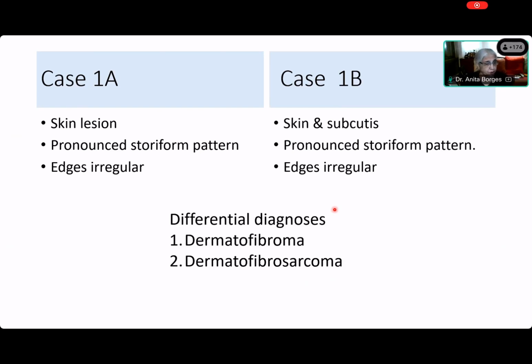Now, what differential diagnosis did you come up with, Saida? Ma'am, case 1B is dermatofibrosarcoma. I see. Okay. And 1A? 1A is ma'am dermatofibroma. Why? Because I can't show you two dermatofibrosarcomas? And why did you think that 1B is a dermatofibrosarcoma? What was your reason for calling it a dermatofibrosarcoma? Saida, you have to give me a reason. Let me ask somebody else. Deepali. Only dermis is involved. Dermis is involved. So? The dermal tumor. So what? That's why it's a dermatofibrosarcoma.